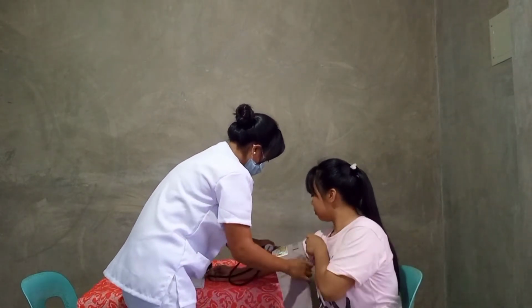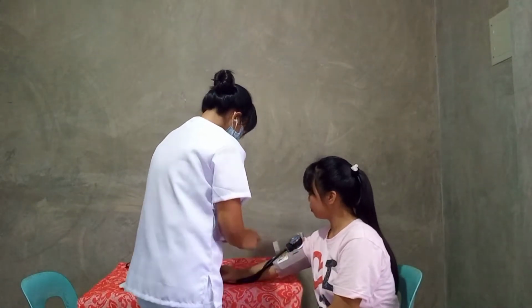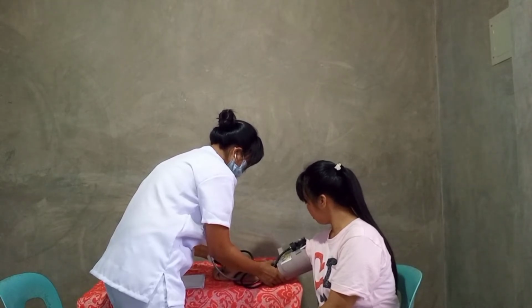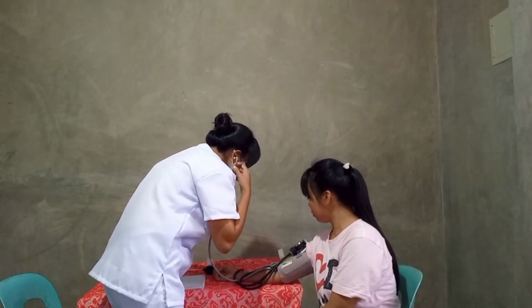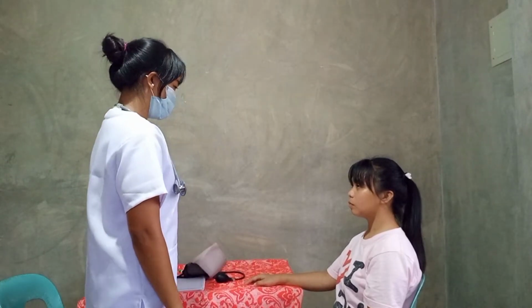And now we proceed to get the blood pressure. And your BP is 120/80, which is normal. Okay.